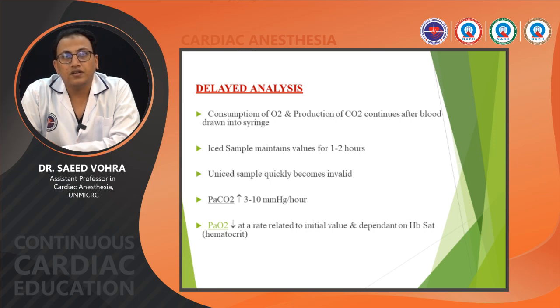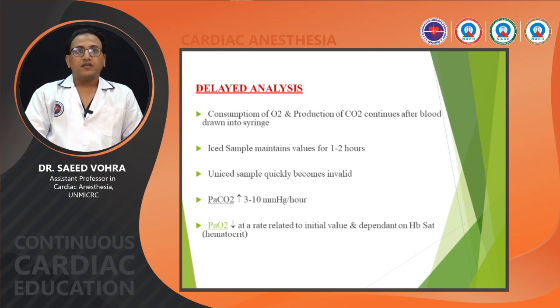An iced sample can be maintained for 1 to 2 hours, whereas a non-iced sample quickly becomes invalid. So PO2 decreases at a rate related to the initial value and dependent on the Hb saturation, and CO2 increases by 3 to 10 mmHg per hour.